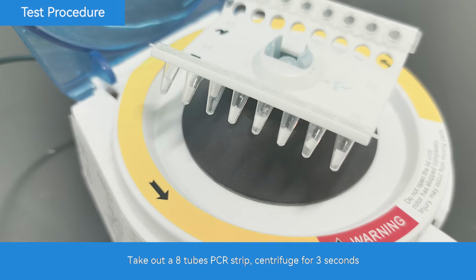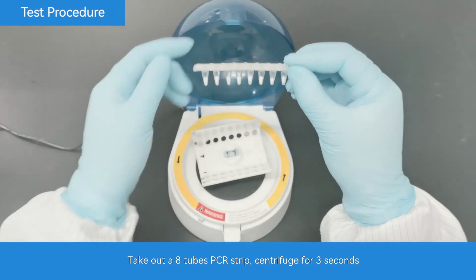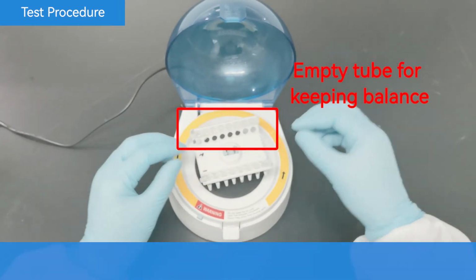Take out an 8 tubes PCR strip. Centrifuge for 3 seconds.